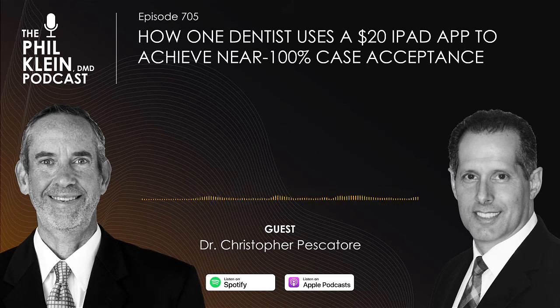And there are advantages to impression material over scanning. Scanning is what you see is what you get, and impression material has those physical attributes that can push the tissue away to capture the margin. Yeah, there's no question about that. People don't realize it. Yeah, that is a big advantage, and it's a great backup.